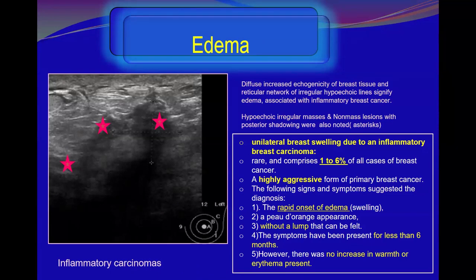During my experience outside Sudan, which represents most of my experience in breast imaging, malignant edema is much less common than systemic and inflammatory etiology. Here I have one more example of inflammatory cancer from that experience, presenting with diffuse edema, as well as these interconnecting irregular masses and non-mass-like lesions, as well as diffuse breast edema with lack of tissue differentiation, some subcutaneous and fascial plane fluids, and thickening of the skin.